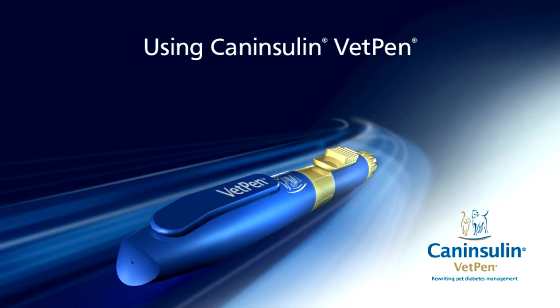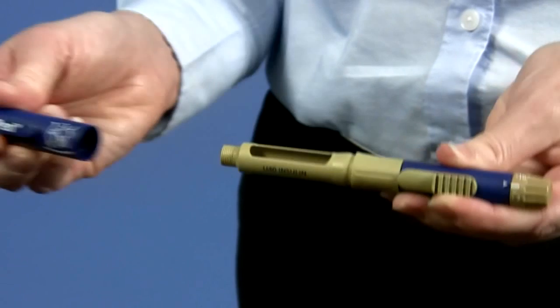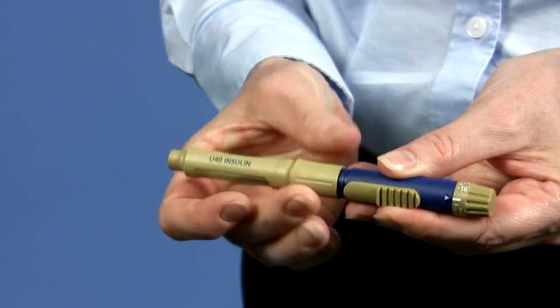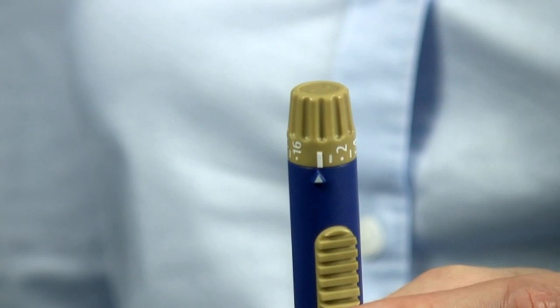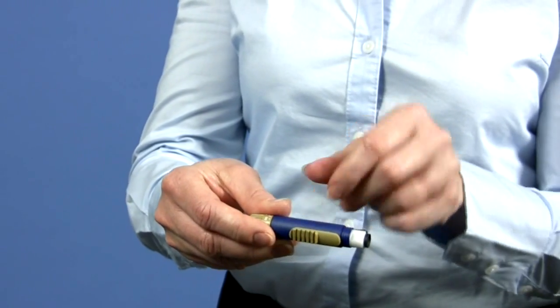Let's take a closer look at how to prepare your pet's insulin injections before using VetPen. We'll start by loading an insulin cartridge. First, remove the VetPen cap. Then, unscrew the VetPen body from the cartridge holder. The arrow on the VetPen body should point to 0, which is the starting line on the dose selector. If it is not, push the release button.